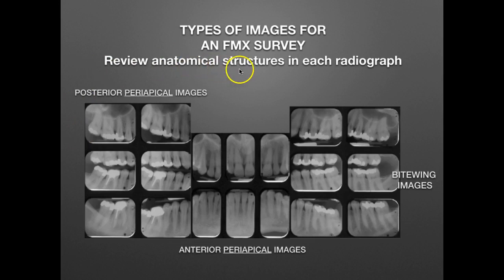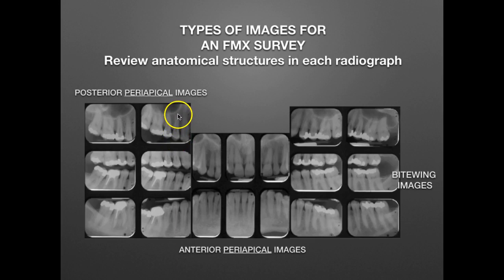As far as anatomical structures, we see the enamel, the dentin, the pulp chamber, the pulpal canal, and any existing restorations. Specifically with a periapical image we have the apex shown of the teeth. Moving to the maxillary right premolar periapical image, we see the premolars and the entire tooth from the root and apex to the crown and surrounding structures — very important in a periapical image.